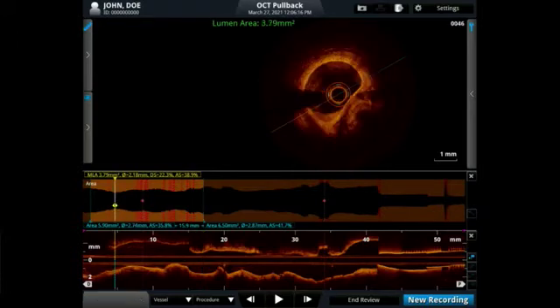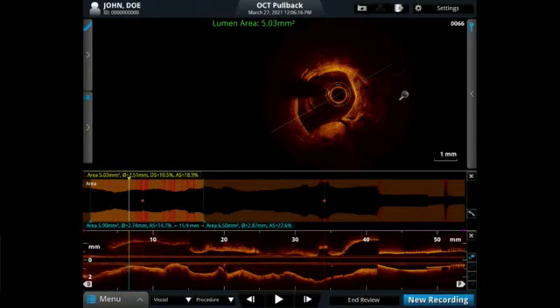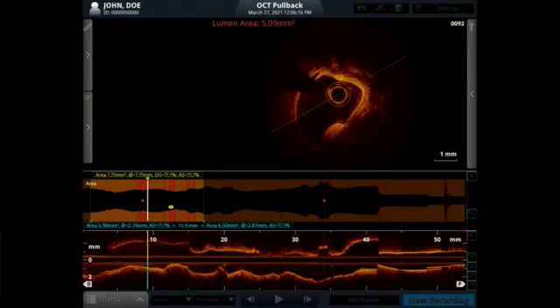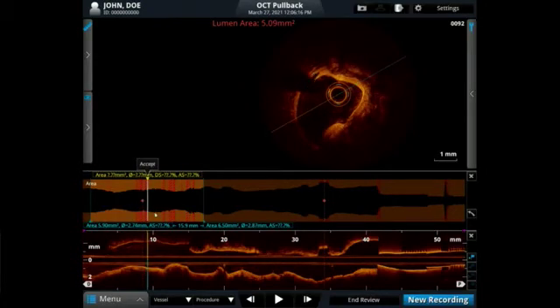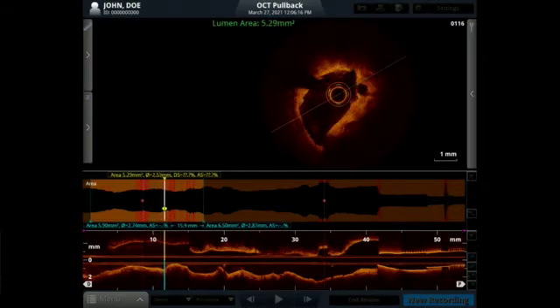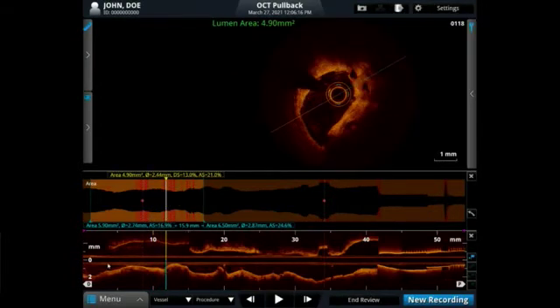And then I think the lesion was right. So guys, you remember this nodule that I showed earlier? There's a crack next to it, and that was a bit more distal to the lesion. And then this was the 180 there. There's a small intimal dissection there, expected. And then I think this was our lesion that no more exists. And I went from 1.5 to 4.9 already.